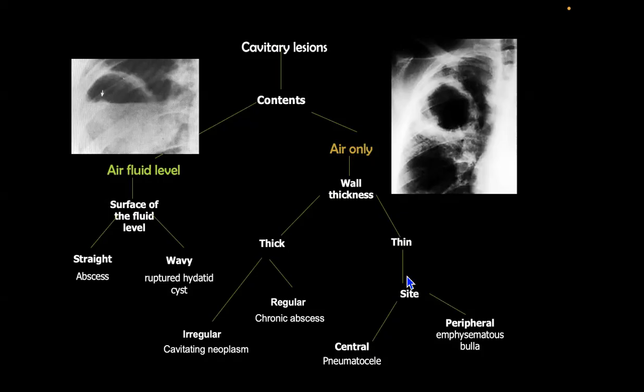Dr. Mustafa, do you think chest X-ray, although you are not practicing clinical medicine, is a part of routine examination? Do you believe that if you didn't do a chest X-ray for a patient who is critically ill, presented in the ER, you didn't complete the examination? Do you believe in this?